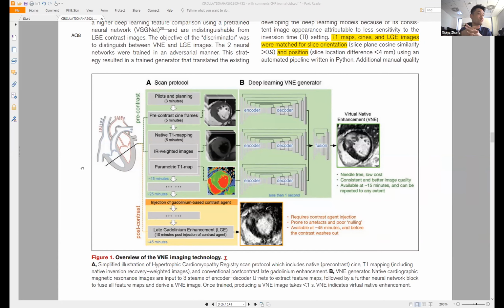And for the T2 mapping data, yes, I think we mentioned somewhere in the paper that incorporating T2 mapping data would probably help improve the performance, because the more information it has, the more it can incorporate in the deep learning models, and under training, they can figure out all the correlations to predict the results.